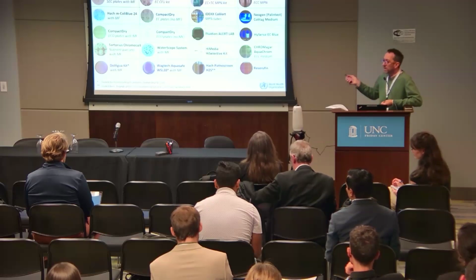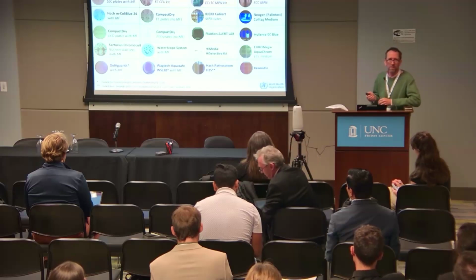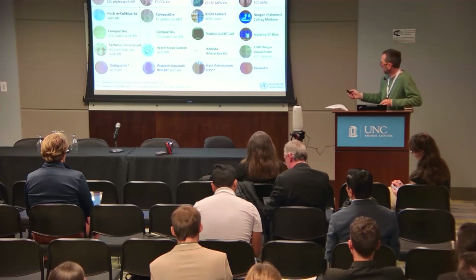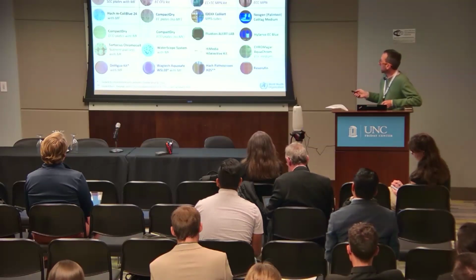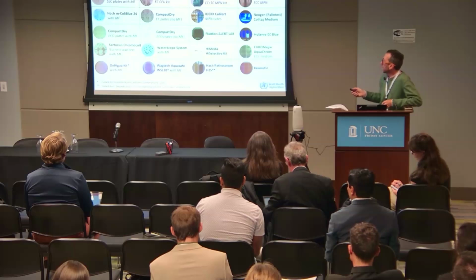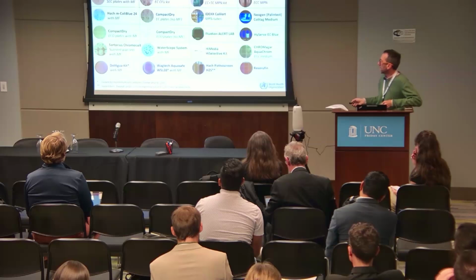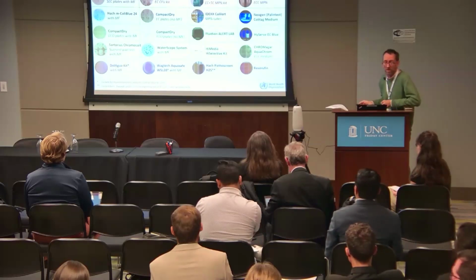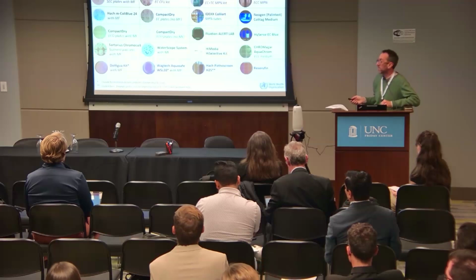Several of them were marketed as presence-absence tests, but in order to assess them, we converted them into MPN methods by using, say, 96 well plates to make an MPN calculation. Most of them were E. coli specific, but there were a few like Del Agua and Aquasafe that are more thermal-tolerant coliforms. And then we did look at the hydrogen sulfide test from HACH.